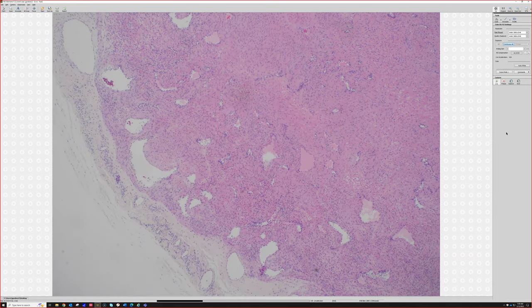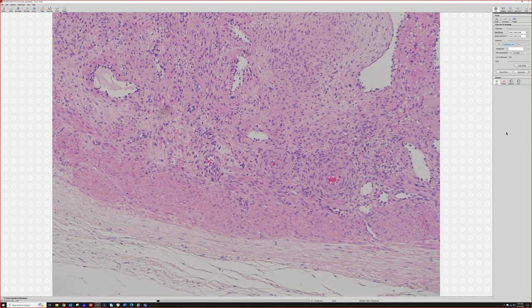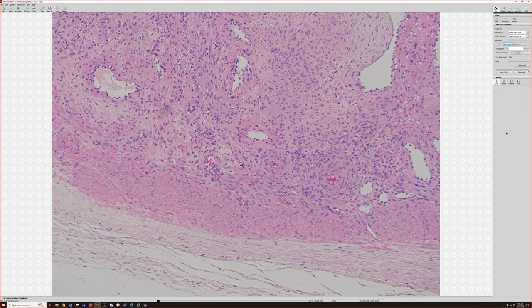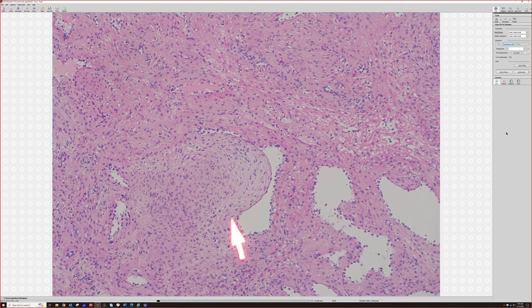What's interesting both about myopericytomas and angioleiomyomas is they often arise in association with a large blood vessel. I've seen this multiple times where you get the tumor either arising on the side of a vessel or, particularly with myopericytomas, inside the vessel. See this? This is a vessel wall out here. That's smooth muscle of the vessel wall. And then here we've got the tumor arising in the midst of it. And see how these spindle cells bulge into the vessel? That is actually something you see in myofibromas. So that would fit with this idea that myopericytomas are linked.